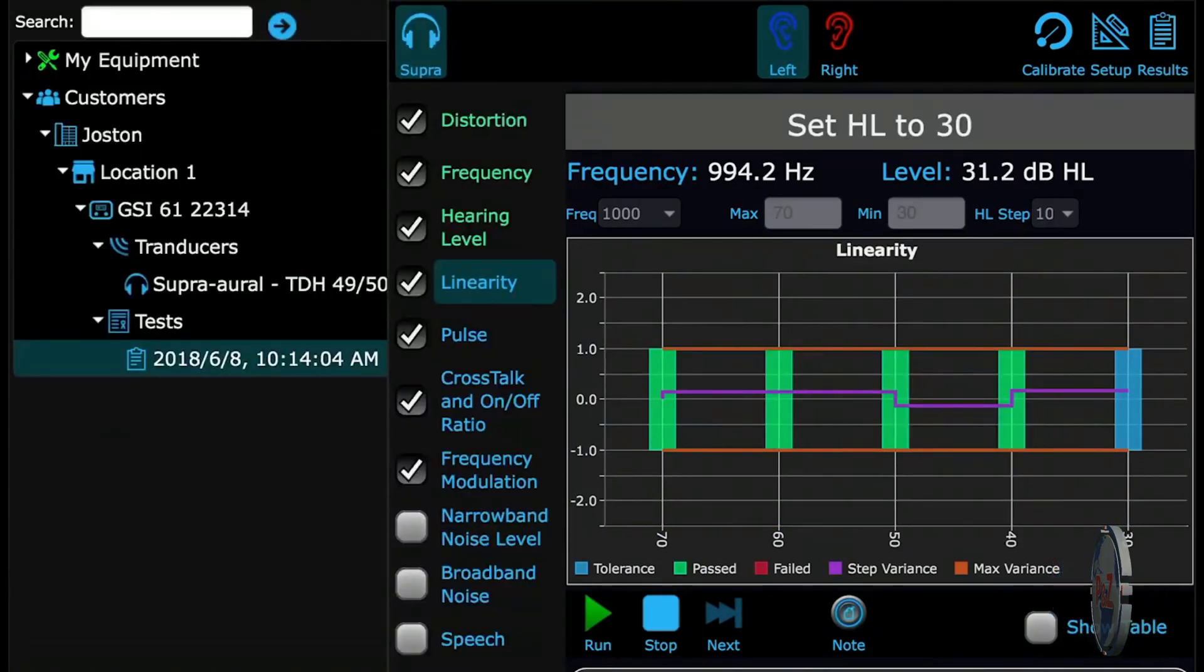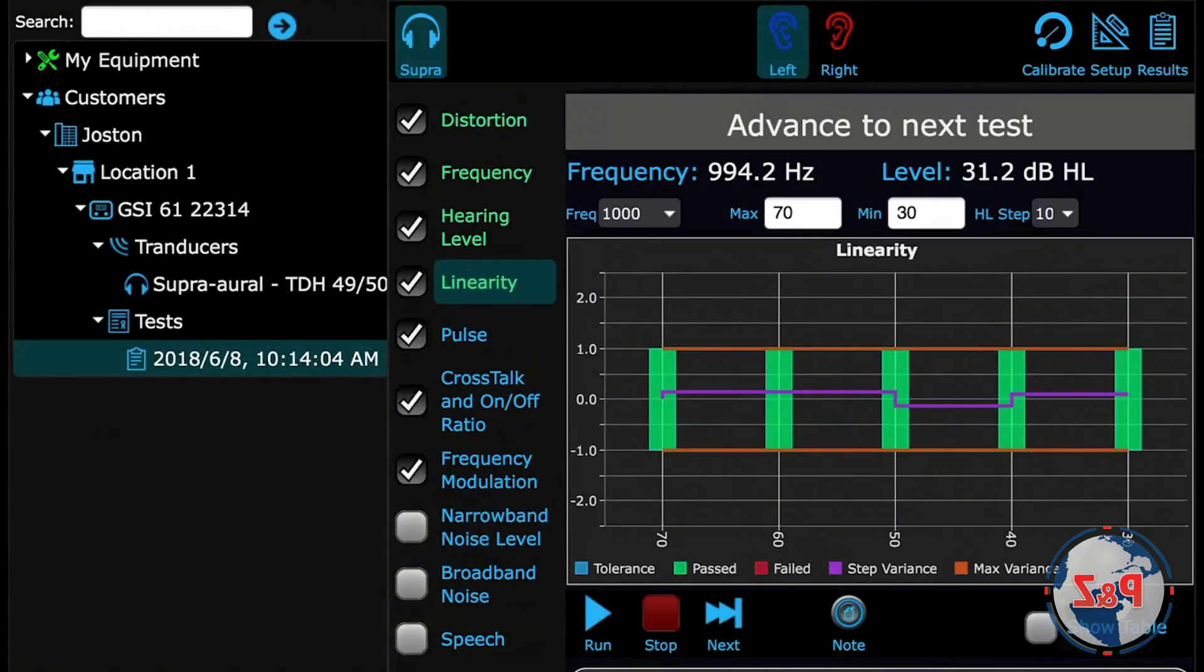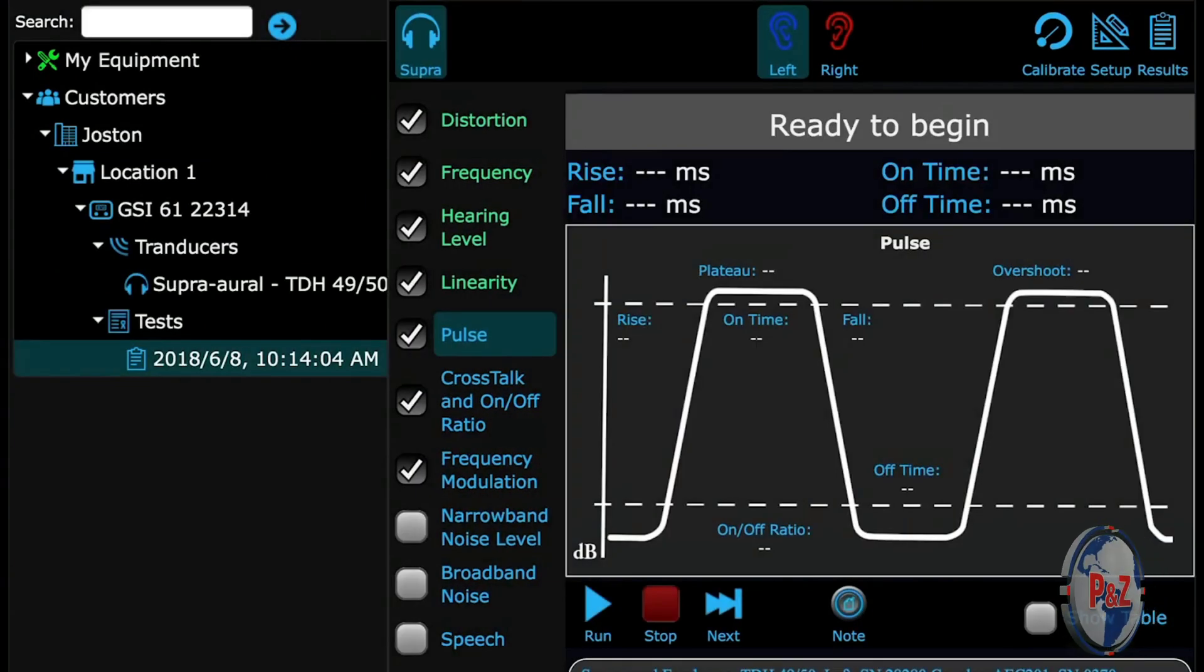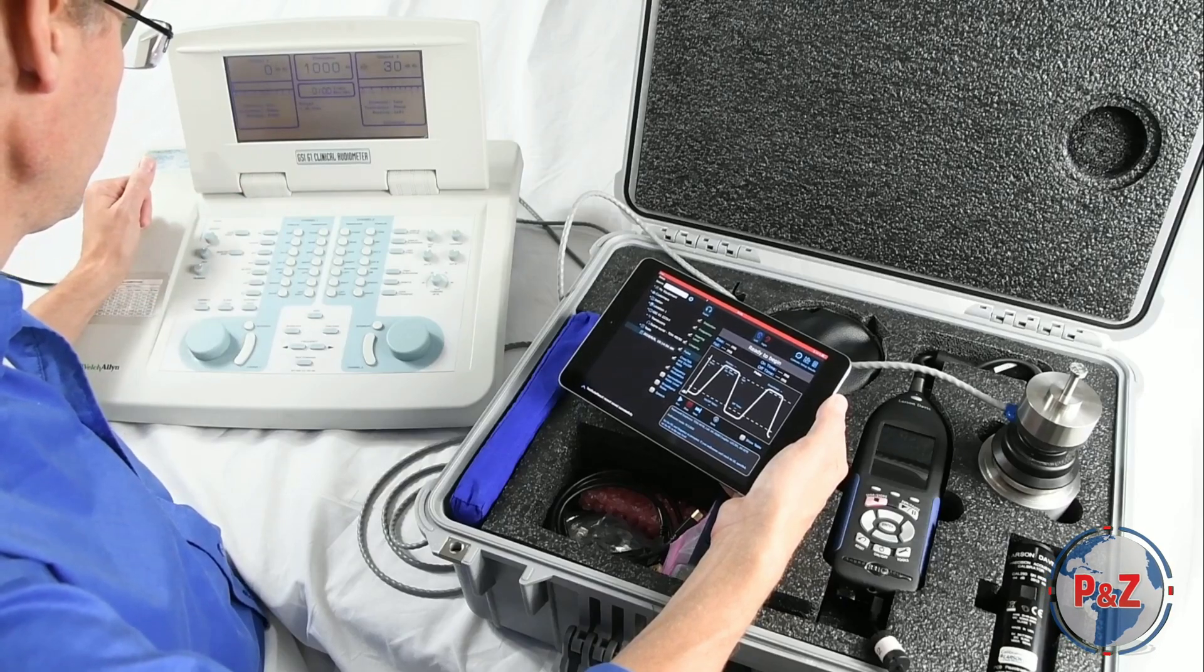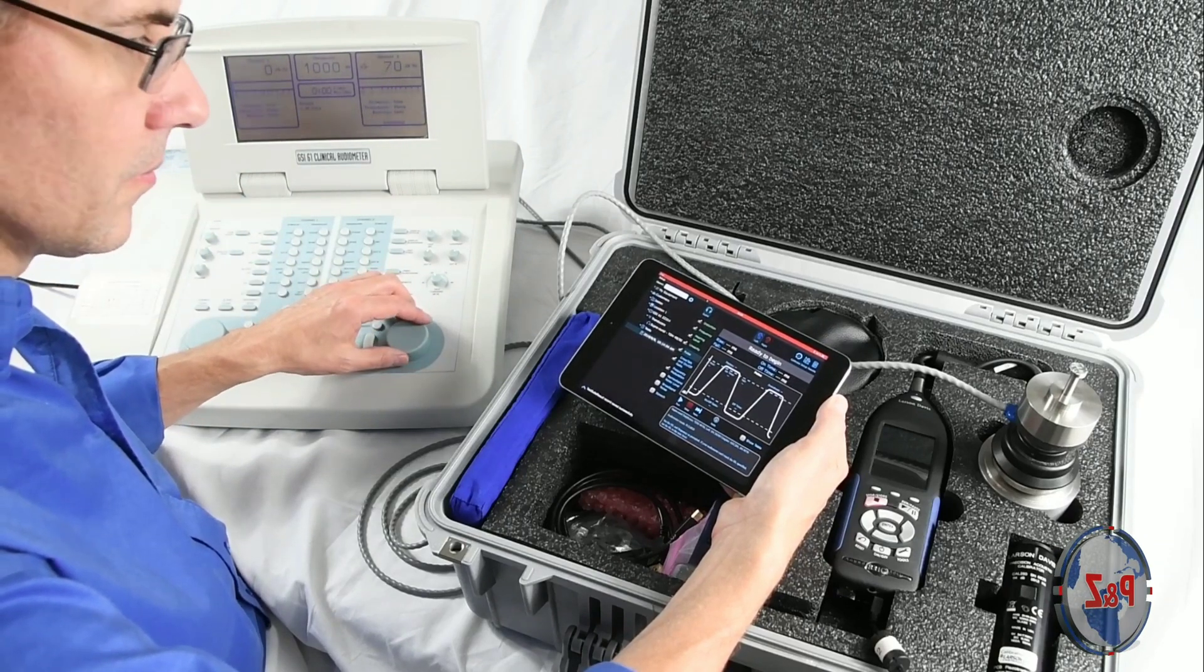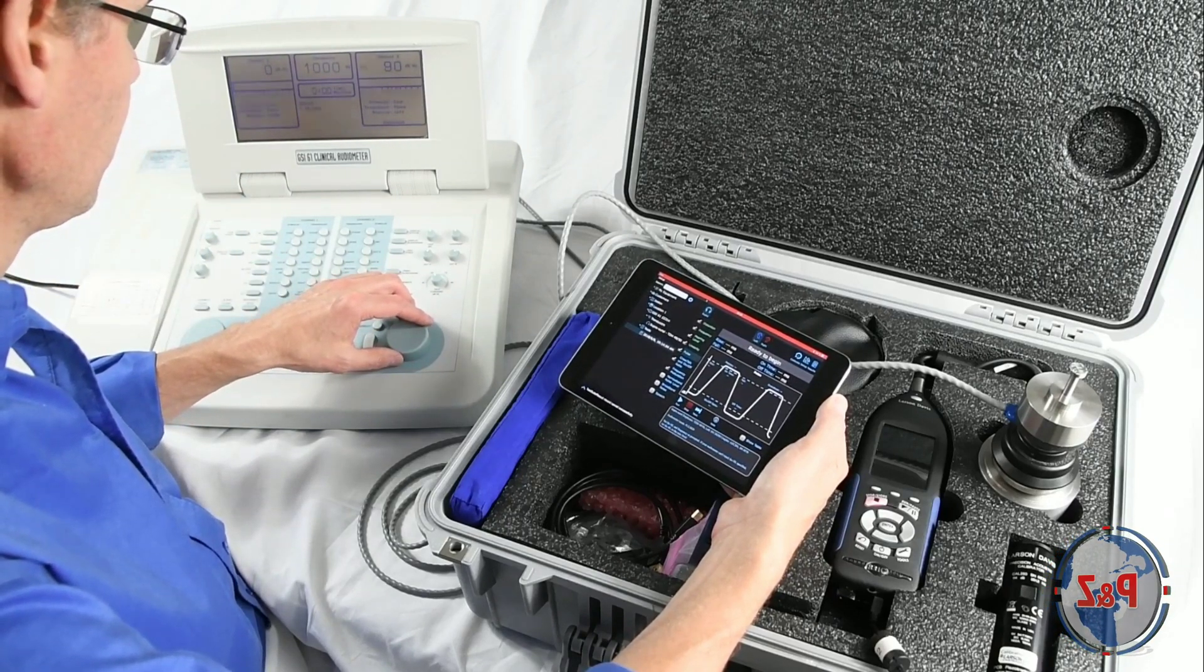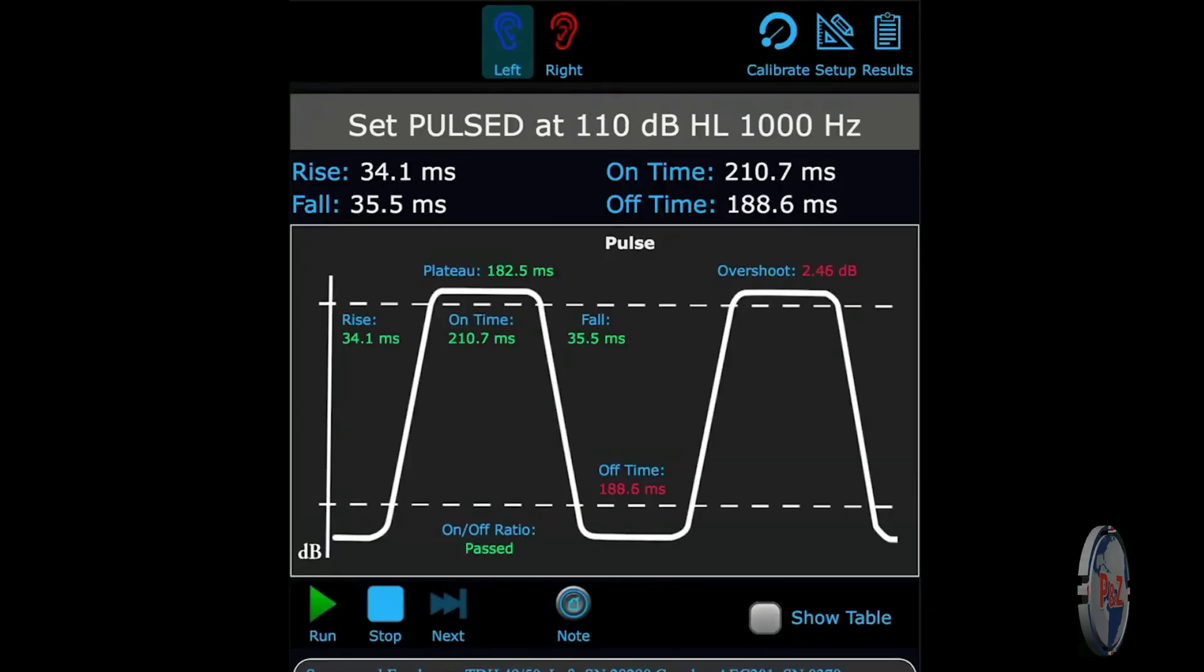The next test, pulse, is a quick test and requires that the audiometer mode be set in pulsed tones. In just an instant after pressing run, the results are calculated. This audiometer failed in the off times for that frequency.